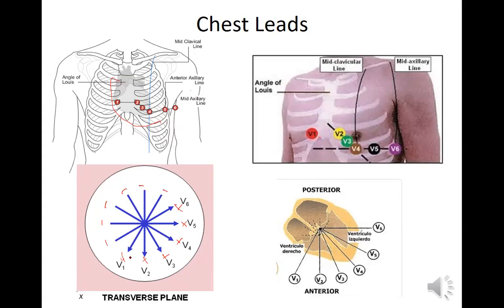Okay. And remember, V1, V2 belongs more to what part of the heart, right or left? V3, Right. V4 is, we could say septal. I mean, there is anterior there too, but just for this class, so you know where we're going, V3, V4 is septal, and that's where the transition should happen. V3 should be negative deflections. V4 should be positive. And then what are we looking at V5, V6? The left side, right? And it's going to be a positive QRS because that's where most of the myocardium is, and that's closer to the mean QRS vector.